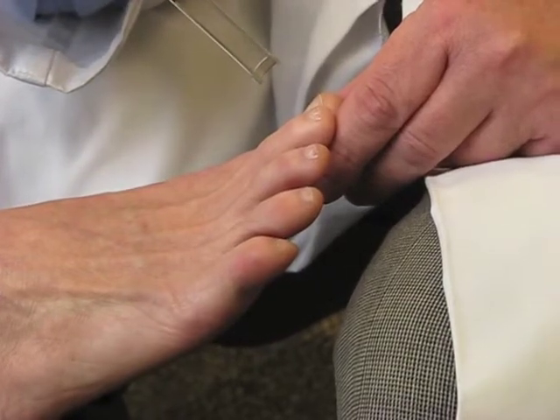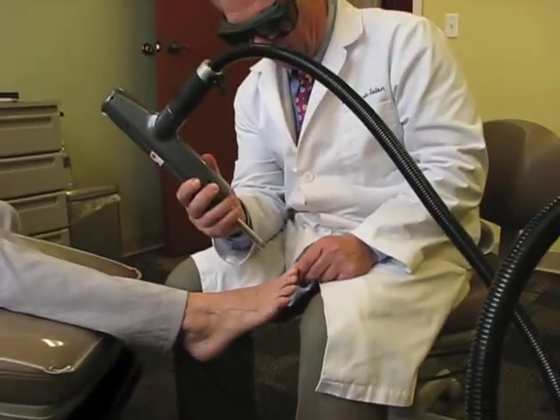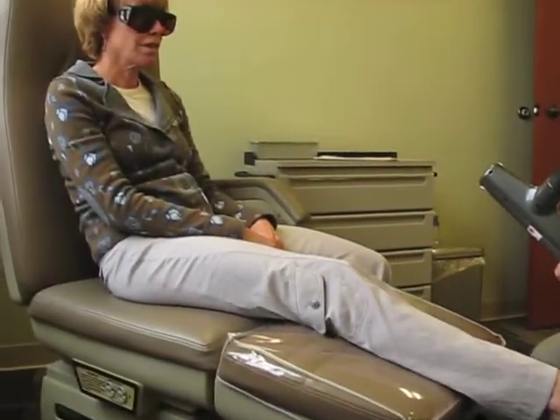Okay, Wendy, I'm going to have you put your glasses on now, and we'll go ahead and treat your toe with the laser. Today we're using the Q-Clear laser to treat your nail fungus, and here we go.